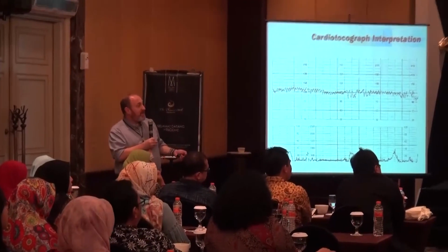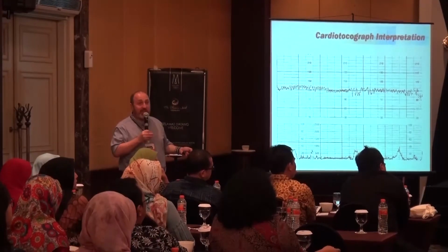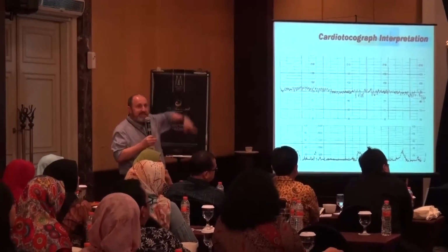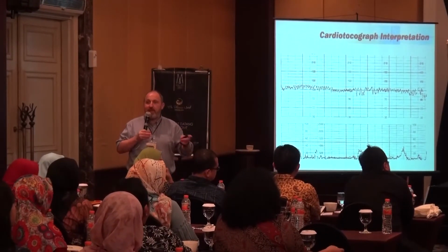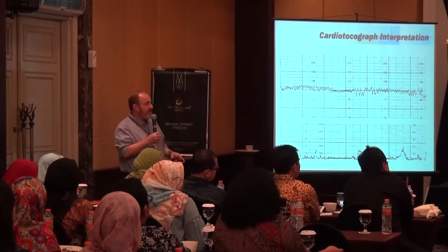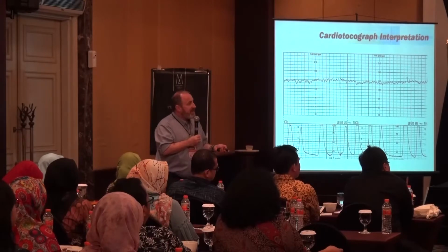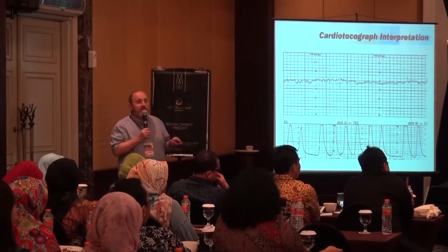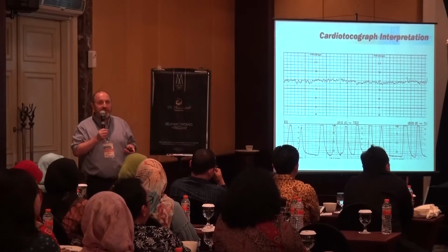How high up, the difference between how high up it goes and how low down it goes, which is called the amplitude, the depth of it, is between about 5 to 15 beats per minute at least. Could be higher, but at least 5 to 15. So if we get another example. Now this tracing, some of you may say, I still don't agree that this is a true sinusoidal tracing.